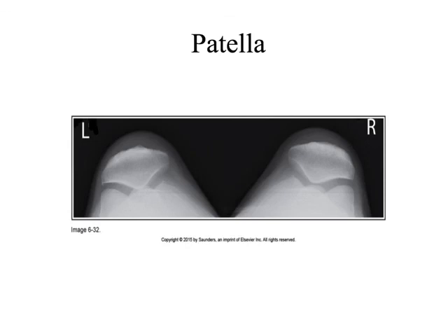The main thing here is we want to make sure that the patellofemoral joint spaces are open with no superimposition. And we are centered. If we're going to try to shoot them both, we're going to be centered right in the middle, right? If we're just trying to shoot one of them, we want to be centered more or less on that joint space.